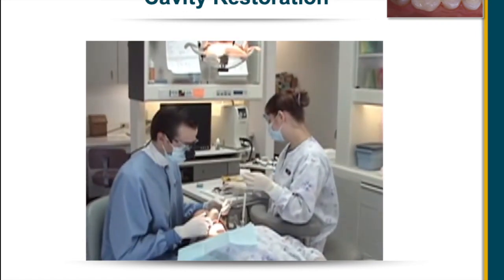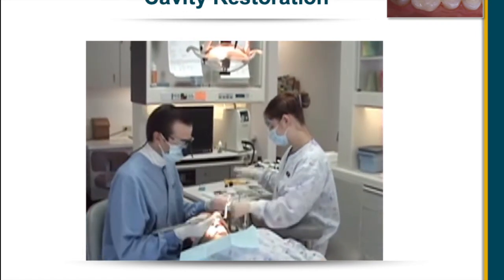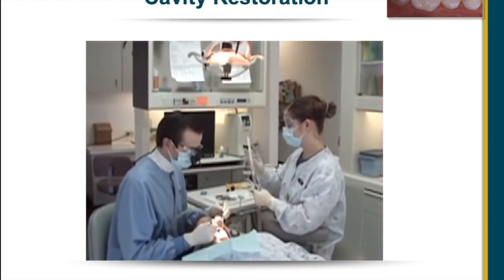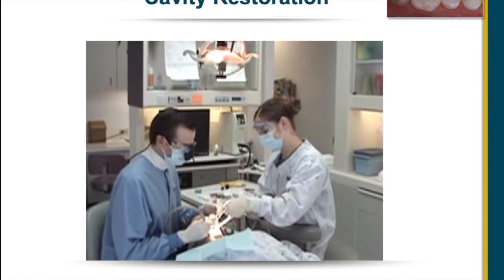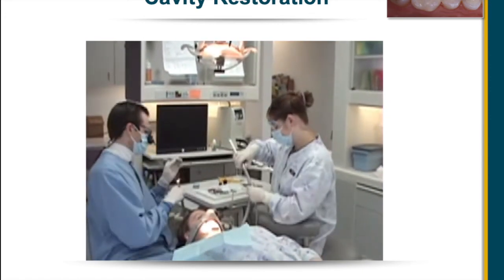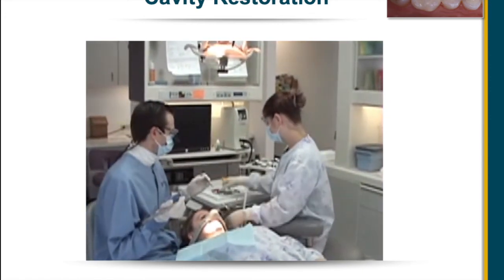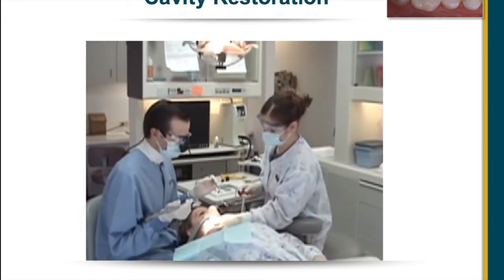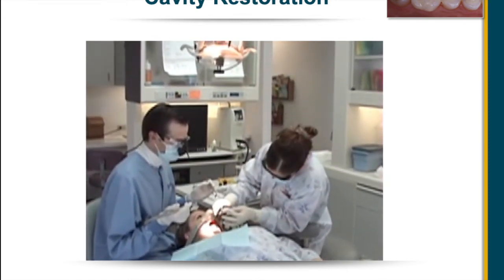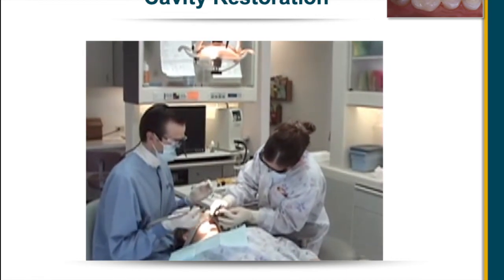The comfort of the patient is also very important. The patient should be positioned with their head slightly above their chest so that all the blood doesn't rush to their head. And the nitrous oxide used in this procedure should be monitored and adjusted as needed for the comfort of the patient.